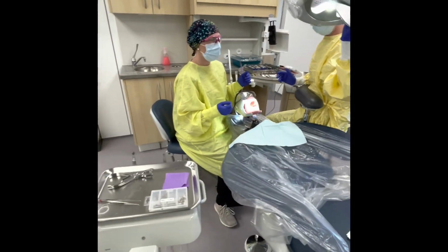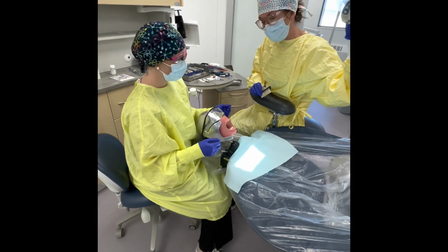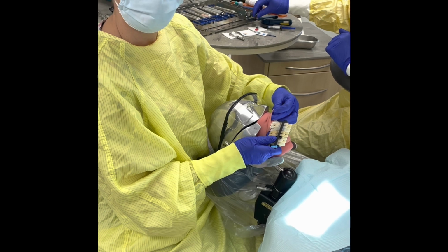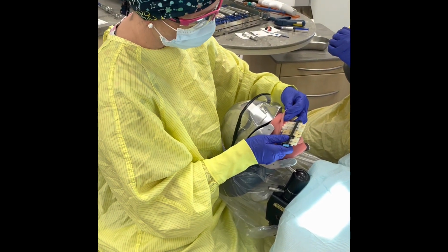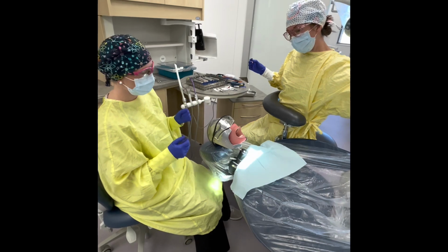The next thing that Stacey is going to do is pass the shade guide. I've turned the light away because picking a shade is better when the light isn't directly on the tooth. So we need to pick a shade because it's an anterior composite and we want to make sure it blends properly with the tooth structure, okay? So Stacey, I will take that A2. Okay, that sounds perfect. Thank you. I'll take that back. Perfect. And I'll turn the light back up for you, Amanda, so that you can see.